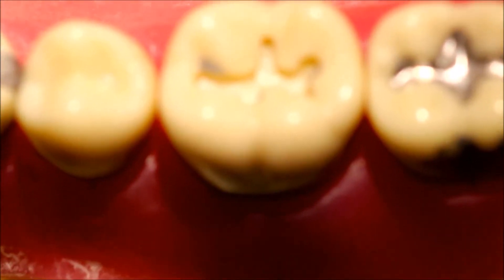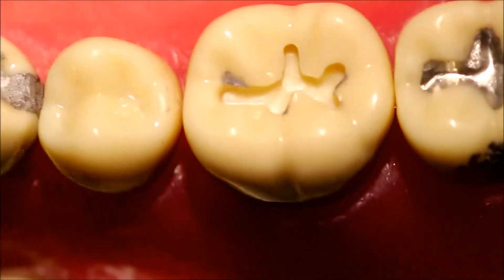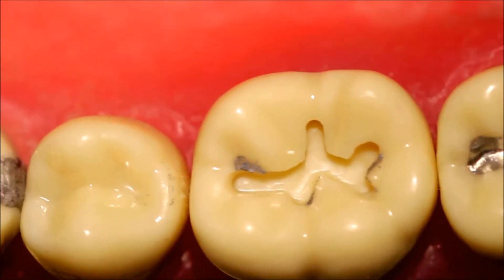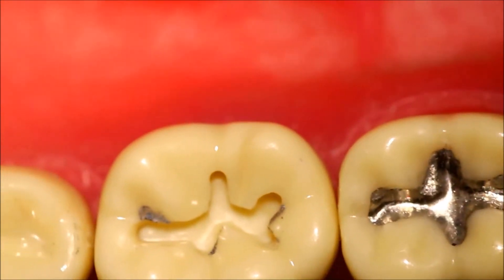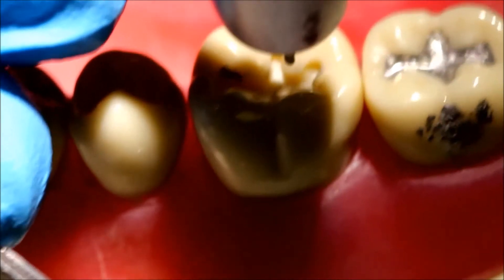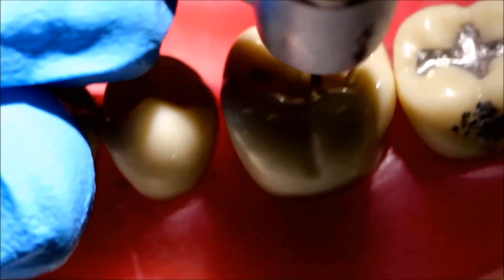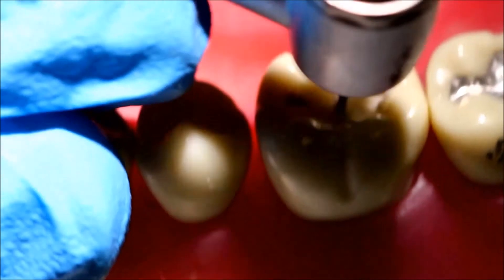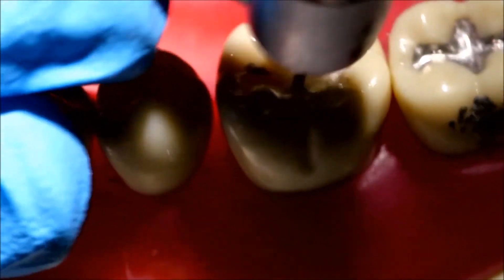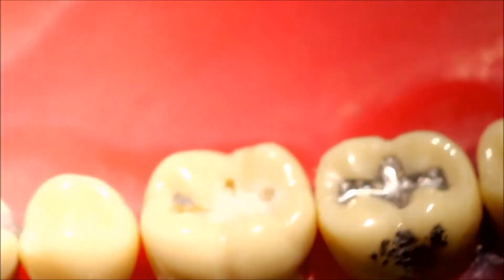Time to do another reassessment. Near the lingual extension and the lingual extension of the fishtail, I have a couple of sharp corners. I also don't have my isthmus as flat or as straight as it should be. So I'm going to go back to my 245 and smooth out all the sharp corners and make my isthmus a lot straighter. You don't want a cusp tip invading into the isthmus — it makes it harder for your restoration and makes it not an ideal prep.